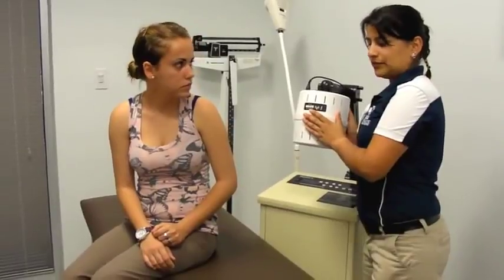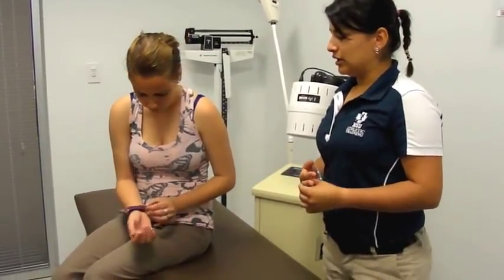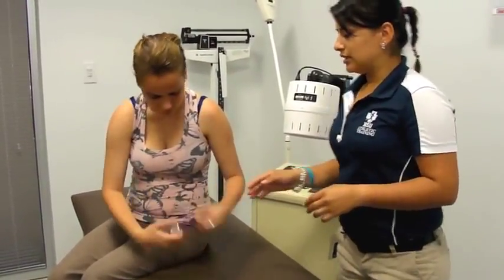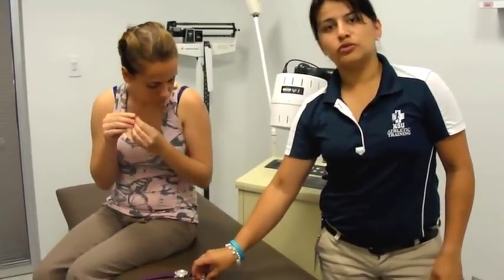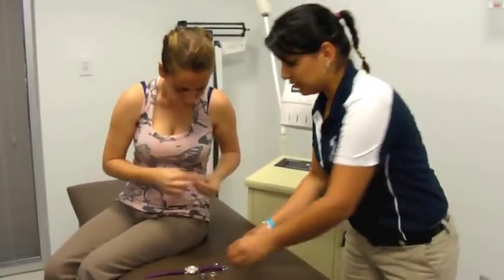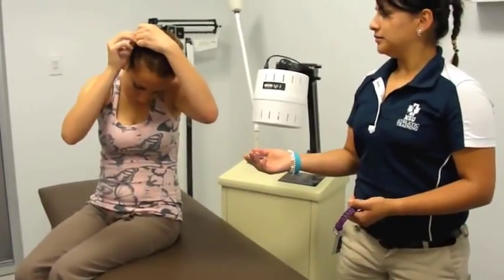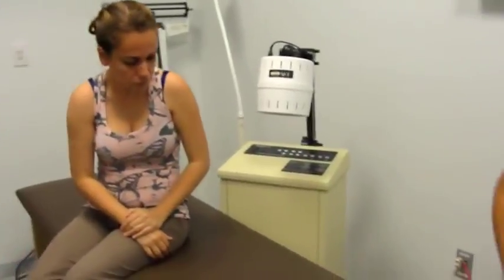One of the most important things to use this modality is that the person needs to remove everything: all the jewelry, all the cell phones, everything needs to be removed from the table. So go ahead and take everything off, your earrings, your pins, because this is an electromodality. If the person leaves this on, it will produce hot spots and possible burns on the skin. Now that she has removed everything, do you have any belly piercings or anything? No. Okay. We have to take it off the table because it can't stay on the table either.